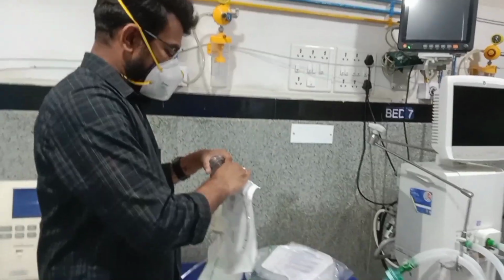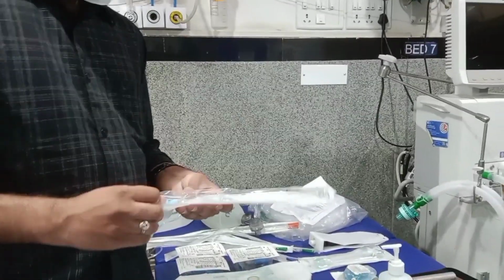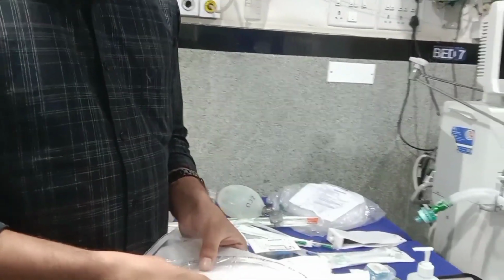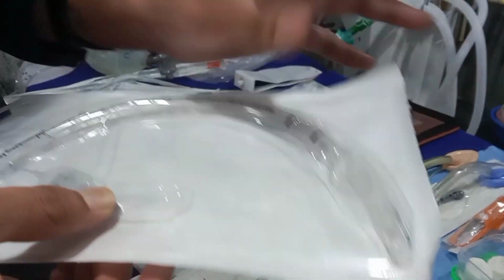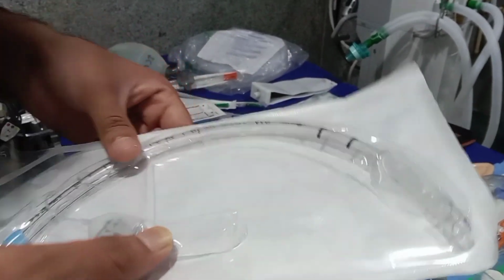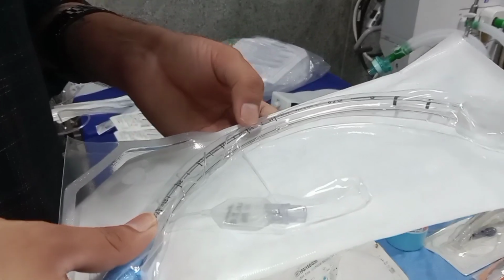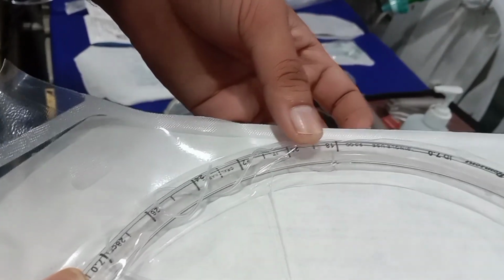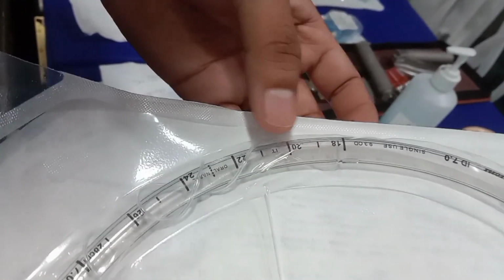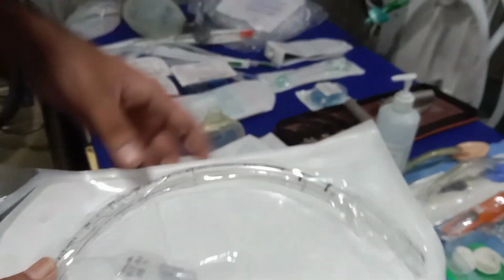Fixing the tube is what we mean is we inflate the balloon of the ET, so that it gets fixed inside at that place. So we fix it at the mouth level. These readings should be at the mouth level. So fixing in the sense, we fix it at the mouth level or teeth level. It should be between 19 to 22, wherever the air entry is free and clear.